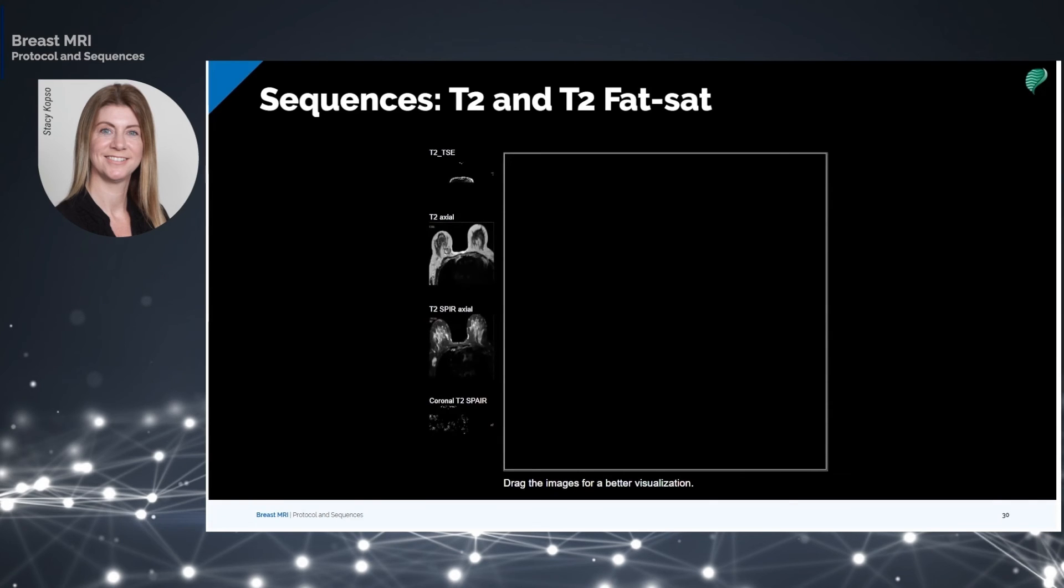T2 TSE and T2 fat suppression. In T2-weighted images, water fluid has hyperintense signal. That is why in T2, water-containing lesions or edematous lesions have intense signals. These lesions can vary from cyst or inflamed lymph nodes to edema surrounding a malignant tumor and fat necrosis.